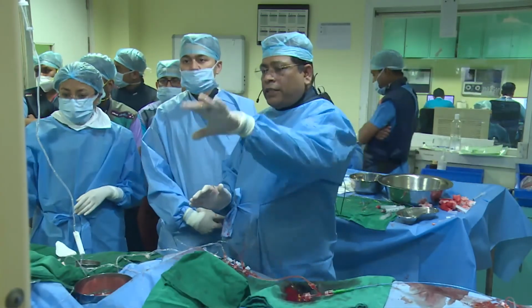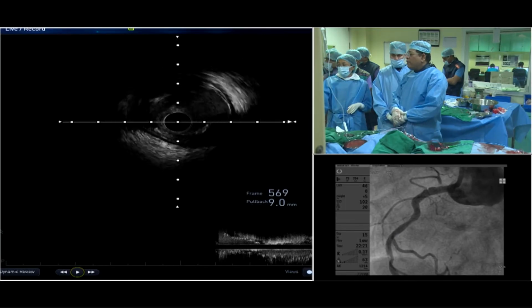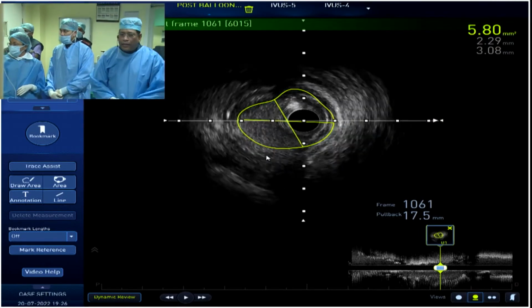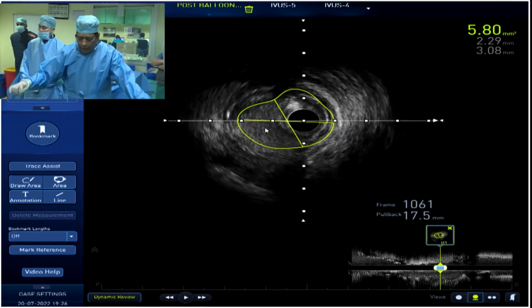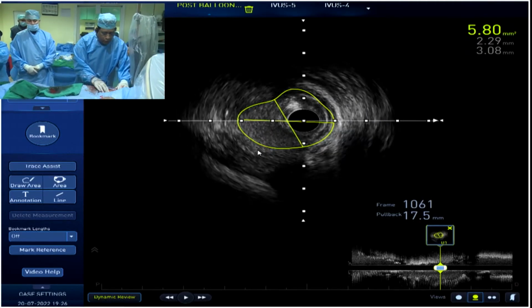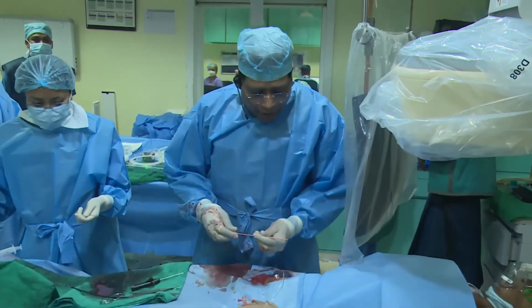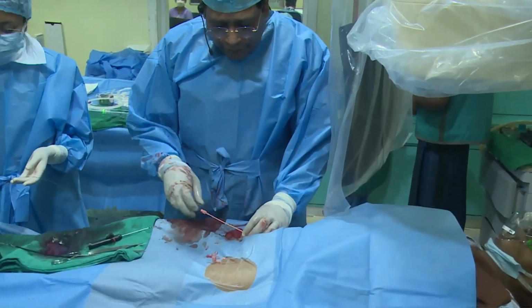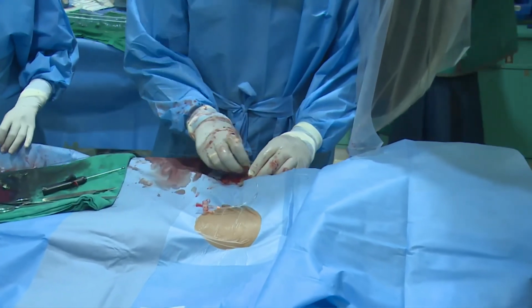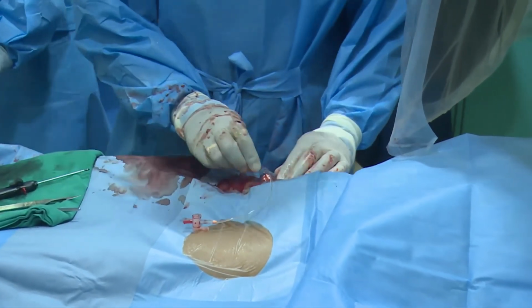Yeah. So this is the image one should look at, and we'll show you the MLA of that place. 5.8. So there is no point, no way it is going to be significant. So I'm stopping here, and now I will do a vascular closure of this. That needs to be demonstrated. Okay. So for final IVUS, we'll show it. So now I will do a vascular closure. These are very important. You leave the patient tension free from the cath lab. Okay. So we have seen everything is fine. Heart rate is 75, BP is 130, no inotropes.